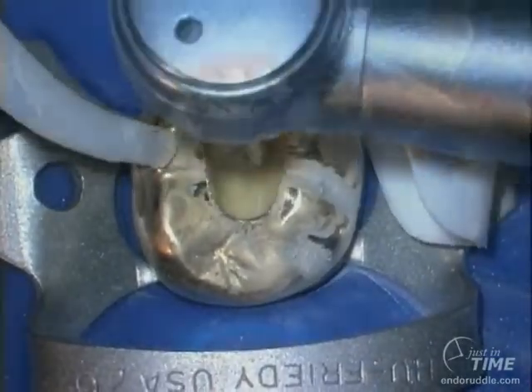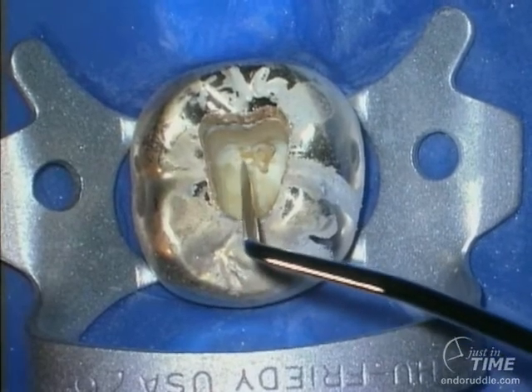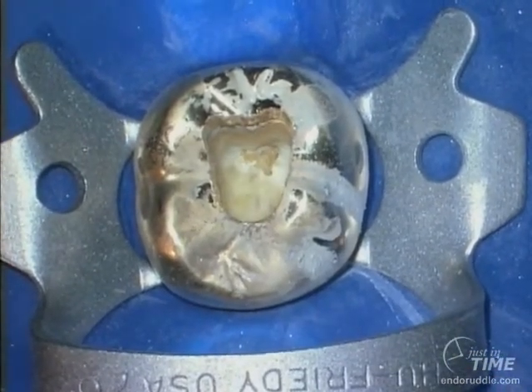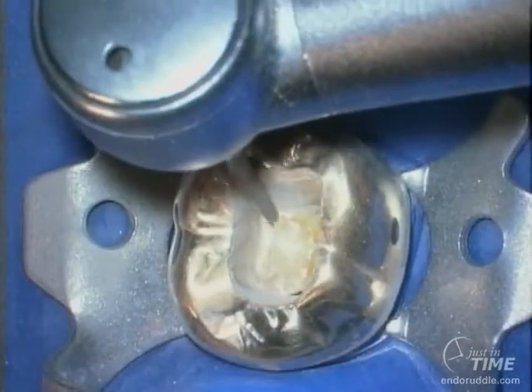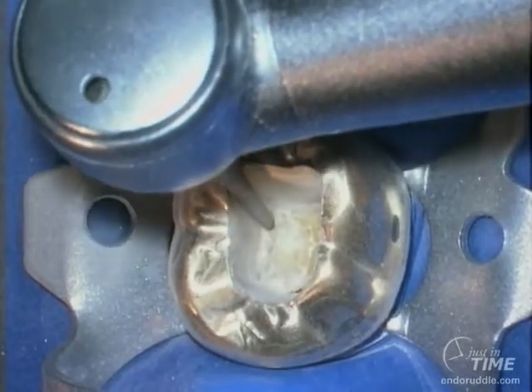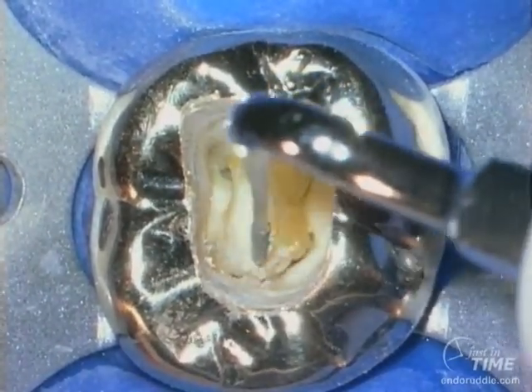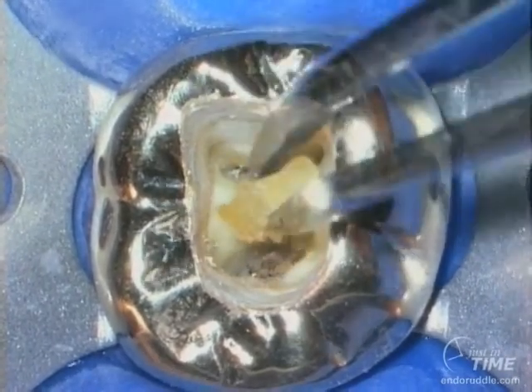You can notice that this is a large stone I'm uncovering and my burr doesn't actually fall into a pulp chamber. Mapping this stone, you can begin to see it's quite large. It's immobile and it's going to require some resection to free it up. So using a surgical length diamond with 12 millimeters of cutting abrasive, we can begin to flatten out our walls, expanding our access walls axially to the mesial. Now that the stone is exposed fully, ultrasound is a very good adjunct to break these things up. Sometimes they'll disintegrate into countless pieces, and other times you'll have the pleasure of removing a fairly significantly sized stone.